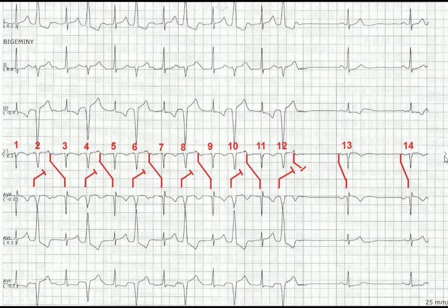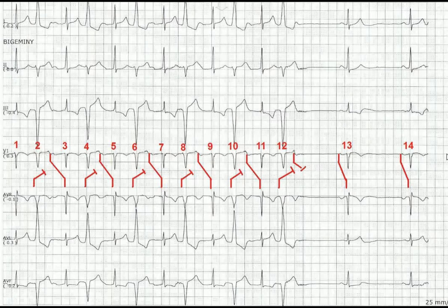It will just manifest as PR interval prolongation. The sinus P wave following the PVCs reaches the AV node during its relative refractory period, so it is conducted with a prolonged PR interval. The AV node is in the relative refractory period because of the PVC traveling retrograde and reaching the AV node.